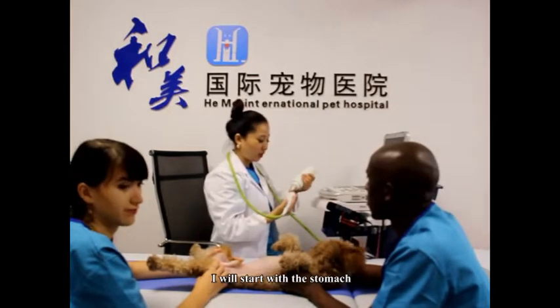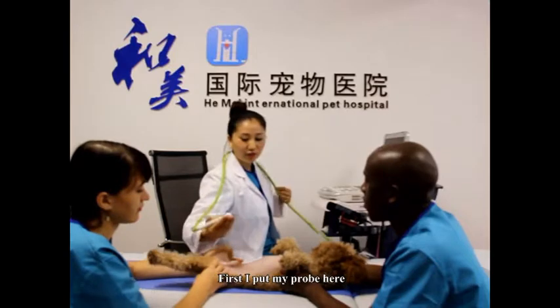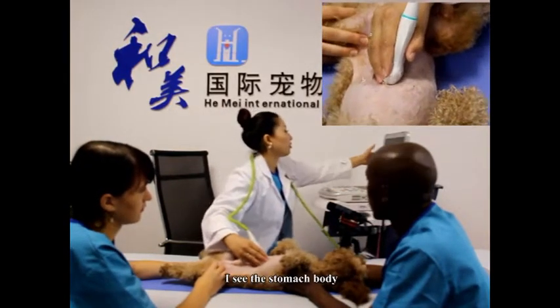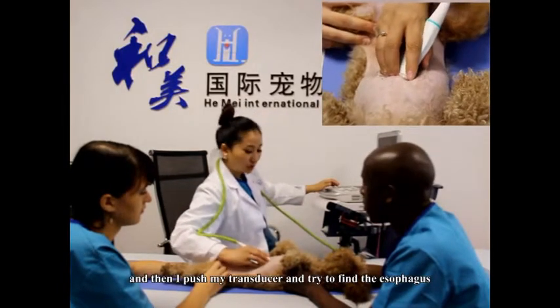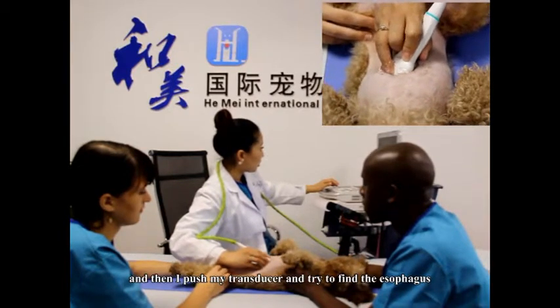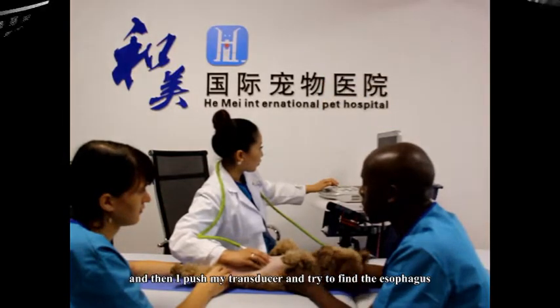I will start with the stomach and try to find the cardiac area first. First, I put my probe here, and here I saw the stomach body. Then I push my transducer and try to find the esophagus.